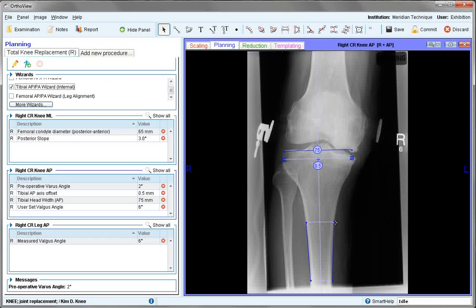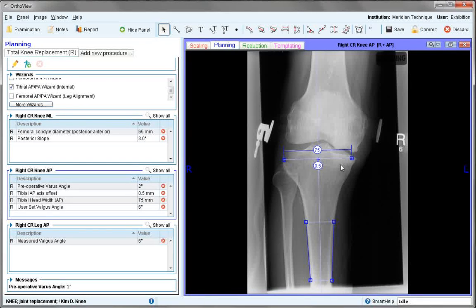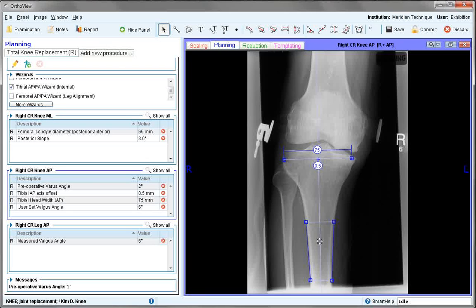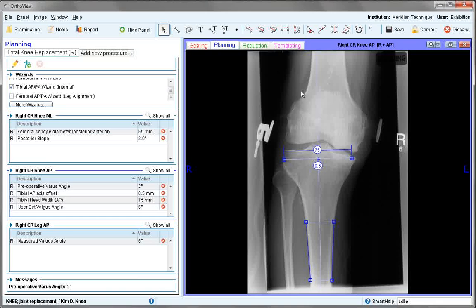The internal tibial AP wizard assesses the anatomical axis, with handles placed across the tibial plateau. The value shown is the offset from the centre midpoint of the axis to the centre of the tibial plateau, which can be useful if long stems are used in some cases. Move the image to templating.